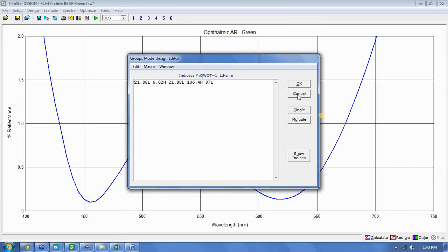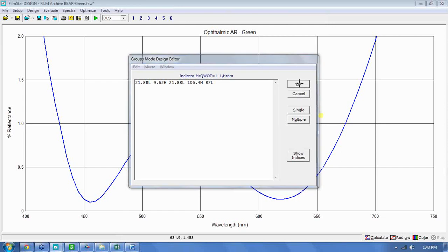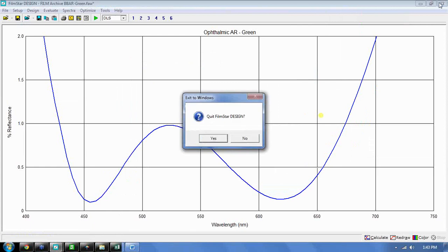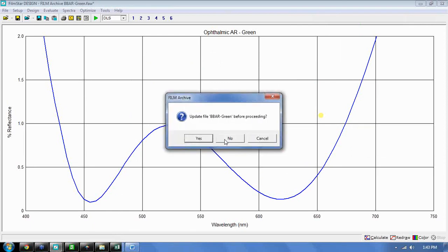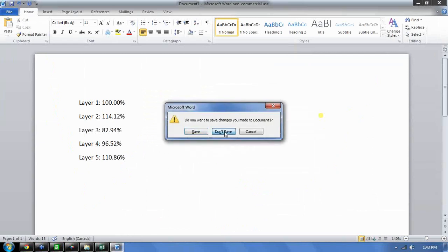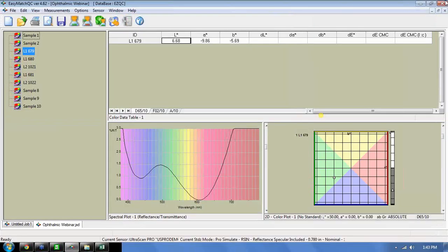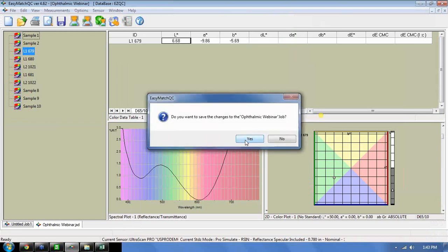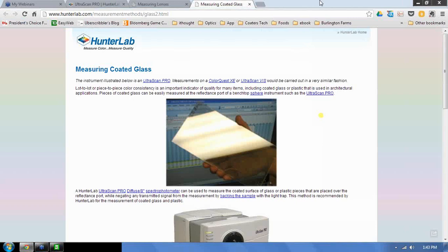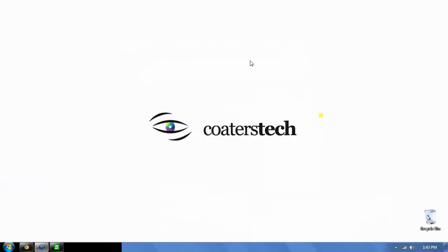Oh, Mohammed, because they are AR and wear resistant. The DLC, diamond-like carbon as I know it, is typically used in infrared applications for protecting outward facing lenses. DLC in ophthalmic applications, because of what I was just saying, won't work.